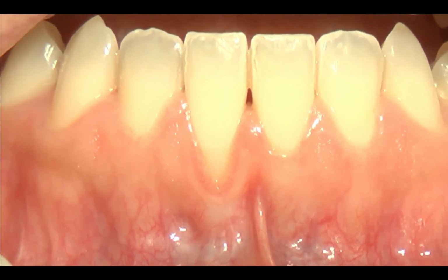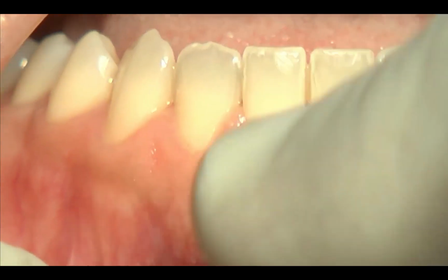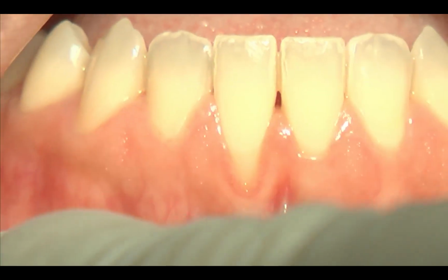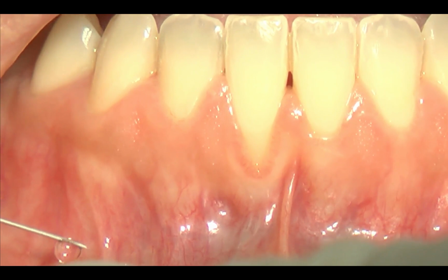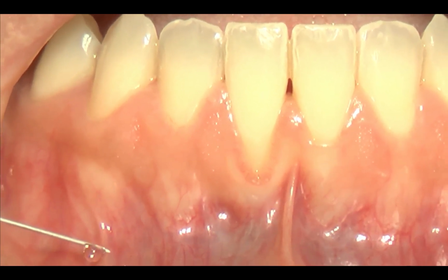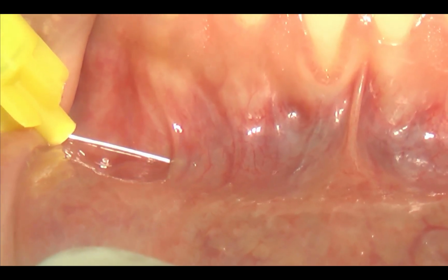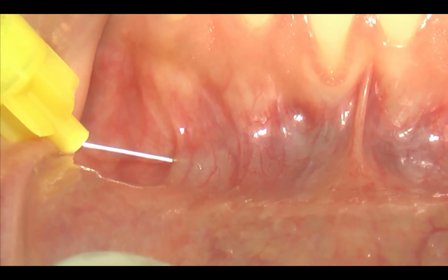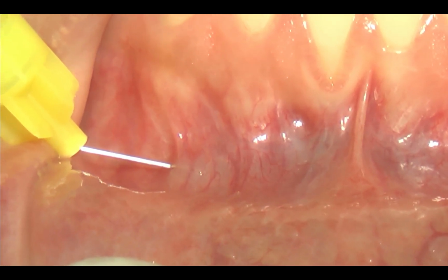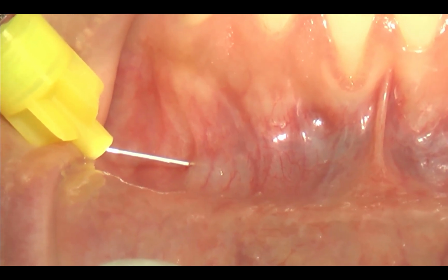Okay, now we make anesthesia. When you make anesthesia, you never make anesthesia in the area of the pedicle, so you are at the level of the canine. You bend your needle and you start with a very slow injection towards the area of the surgery.